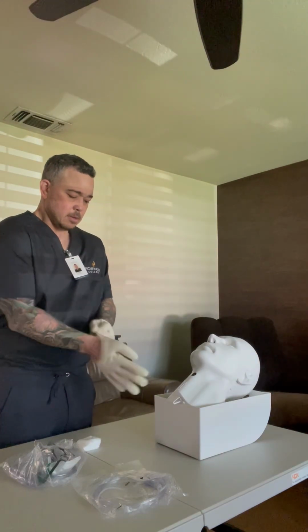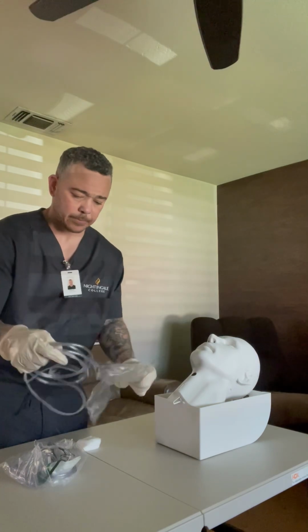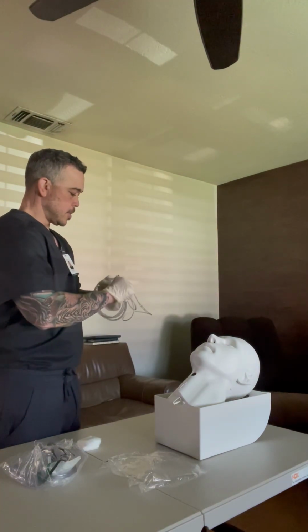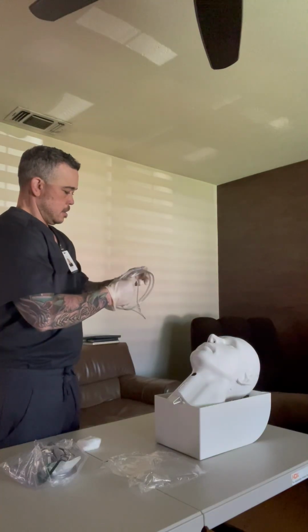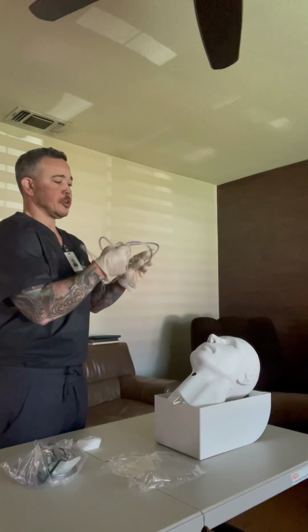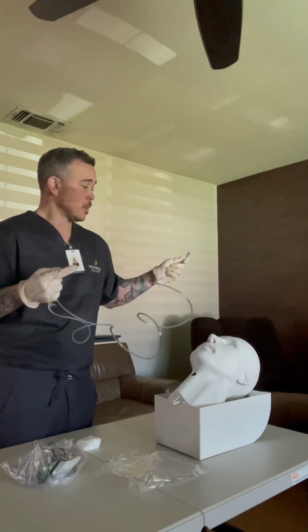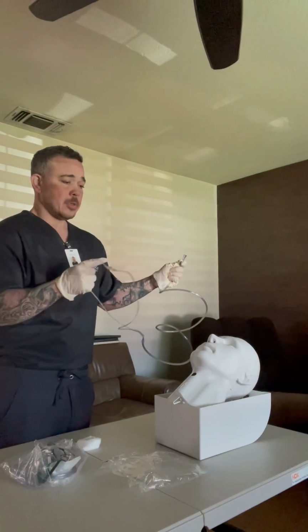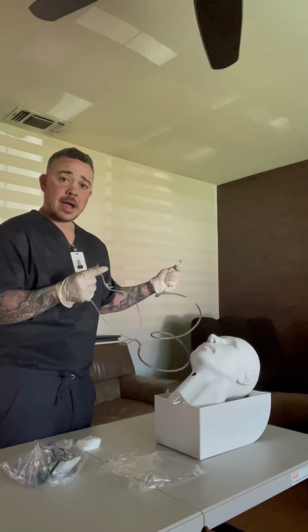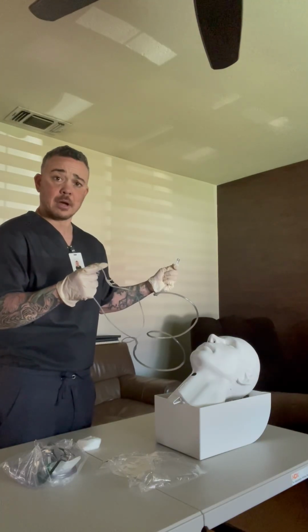Okay. All right, got my gloves on. I'm gonna go ahead and get my nasal cannula. Okay, so you got the nasal cannula here. All right. So this end here is actually going to be attached to the flow meter that is on the wall. And on the flow meter, there are going to be two dials. One is green, the other one is yellow. The green dial is labeled oxygen, and the yellow dial is air.